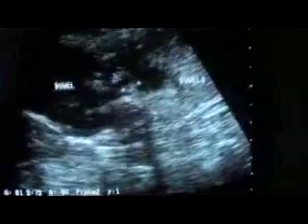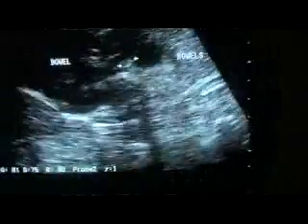So there is extension of this abscess formation in this possibly distended, dilated bowel segment into the adjacent bowel segment. So there is extension of this fluid material from this bowel segment in the right upper quadrant of the abdomen into the adjacent bowel.